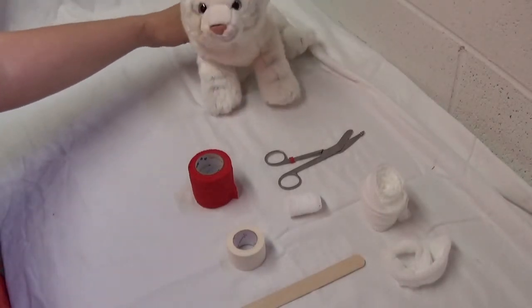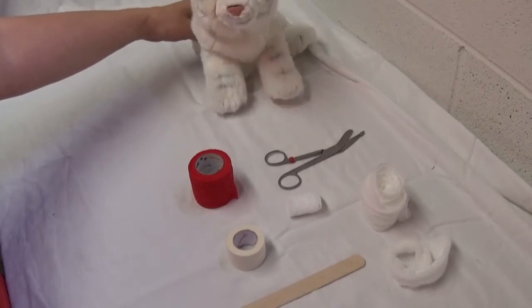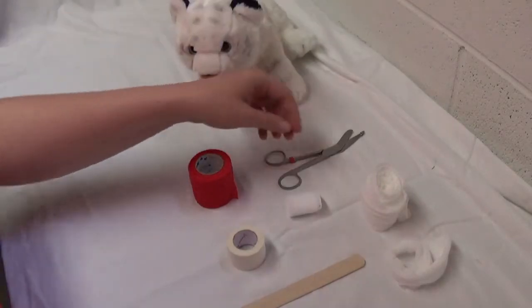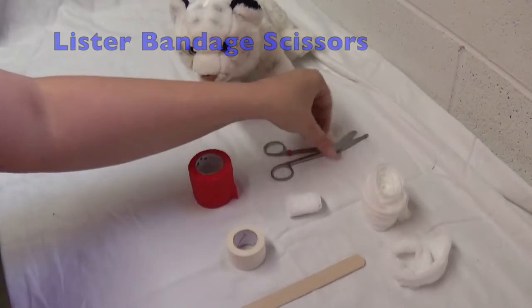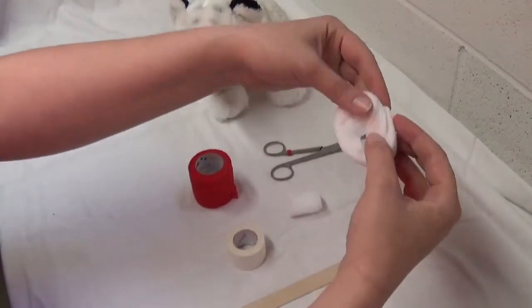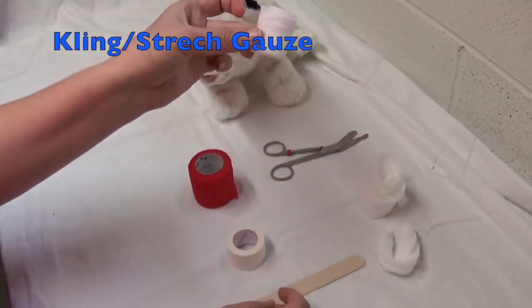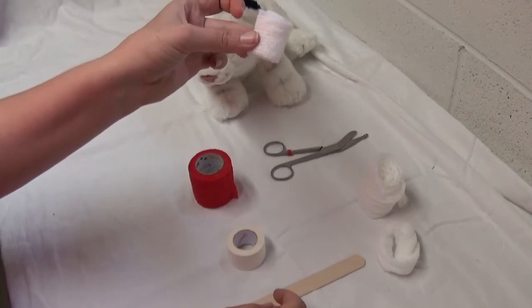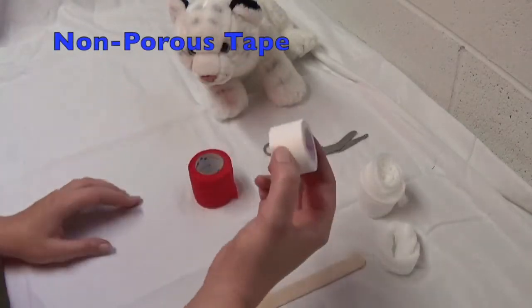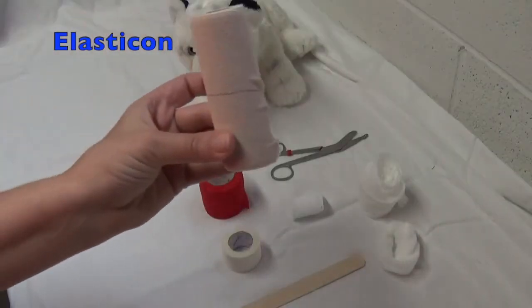First thing you need is your patient — hopefully under sedation, anesthesia, or some analgesics. Then you need your trusty bandage scissors as well as your cast padding. You may want to make a little donut with your cast padding. You'll also need your cling or stretch gauze, non-porous tape, vet wrap, and elasticon.